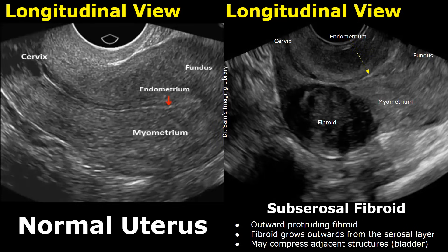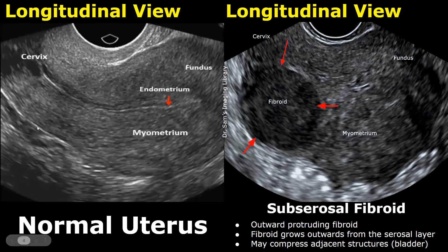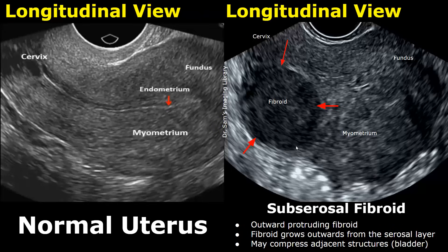The outermost layer of the uterus is the serosa and this is where a subserosal fibroid is found. We can see this fibroid protruding outwards, so this is a subserosal fibroid.